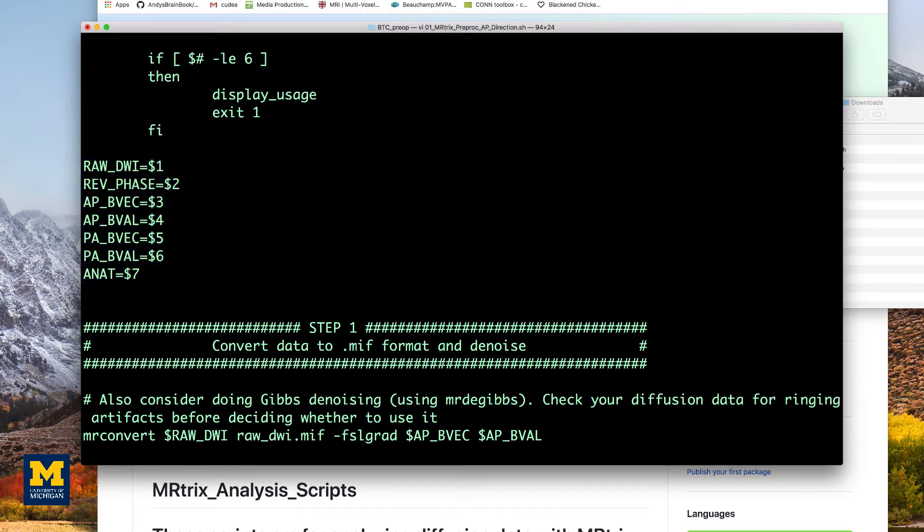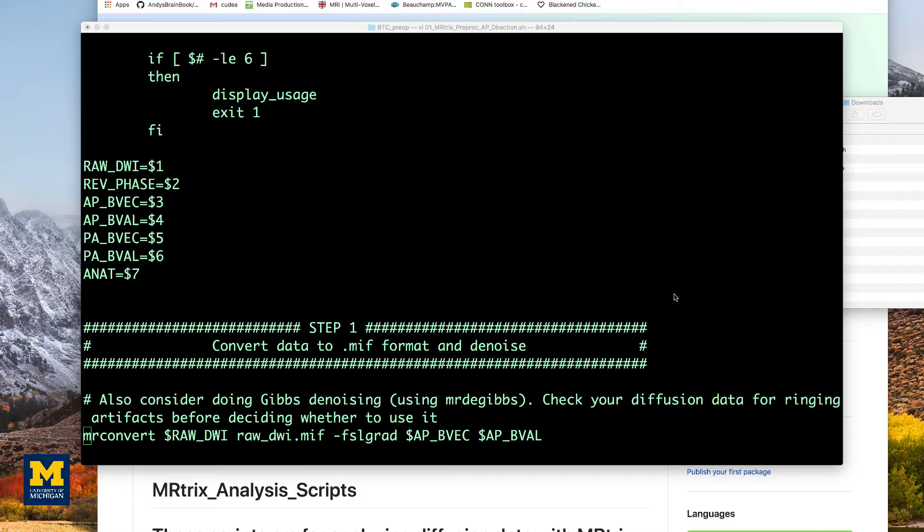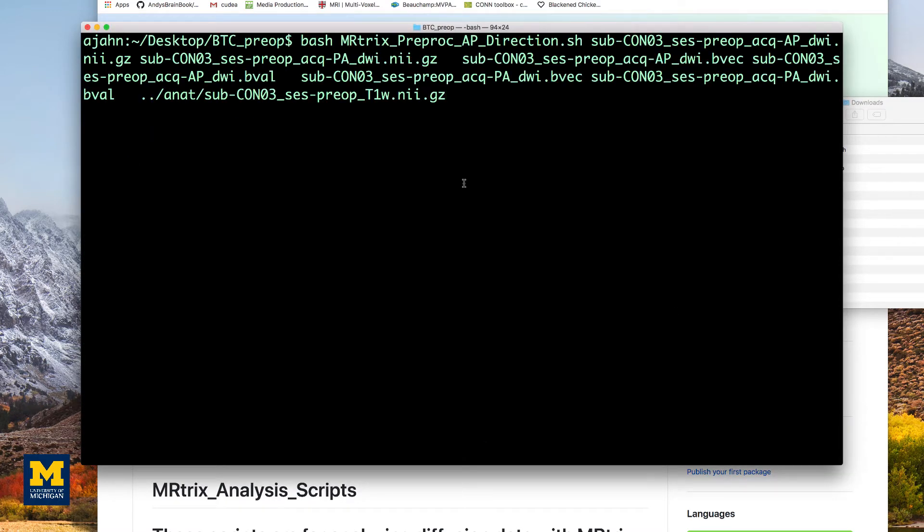For example, if I use colon Q to exit this script in the VI editor, the command would look something like this.